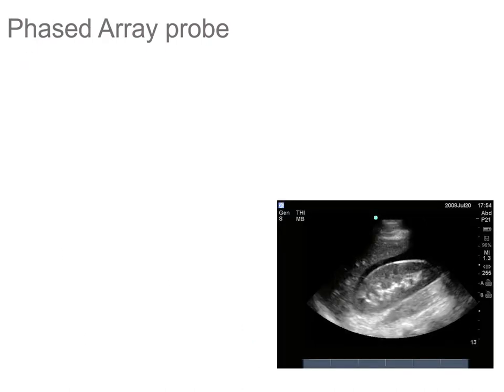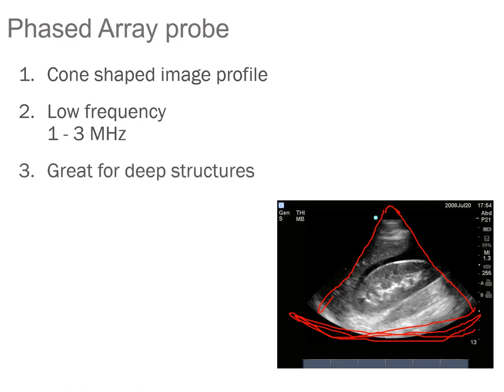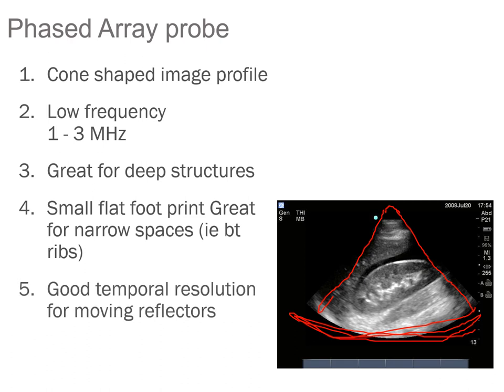Now we have the phased array probe. This one works like a windshield wiper in that it sweeps across the footprint, which is quite small, back and forth to create the image. So it looks like a piece of pie or wedge shaped without the bite coming from the top. It is more of a cone shaped profile. Again, it tends to be the lowest of the frequencies for these particular probes. Really good for deep structures, and because it has a small footprint, you can get through narrow spaces like between ribs, so it's good for cardiac ultrasound. That's sometimes known as a cardiac probe.